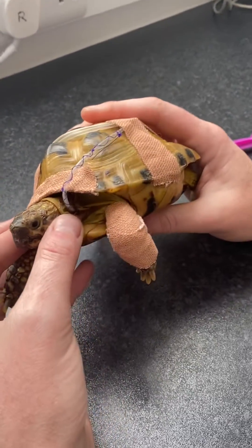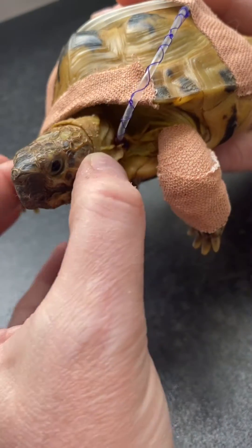On this little guy, you can just see on the side of his neck the tube going into the side of his neck.